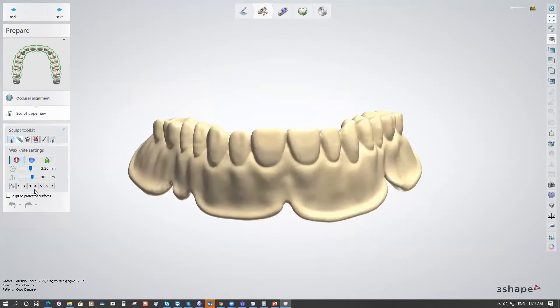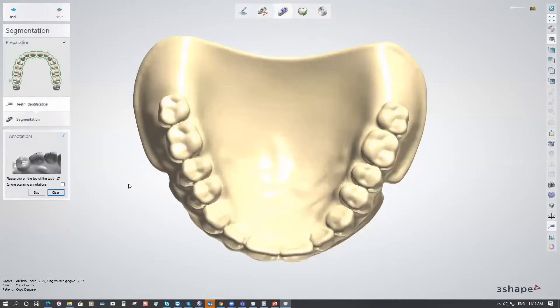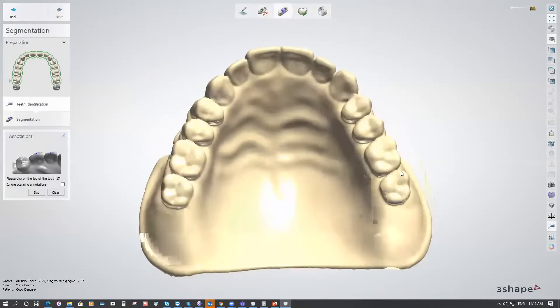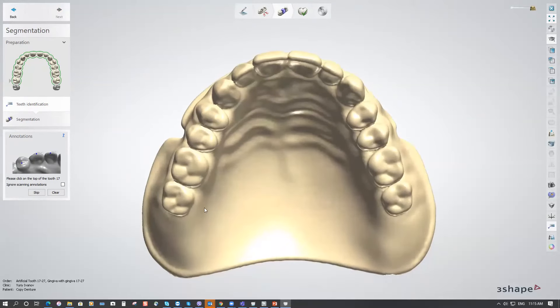Here you can use the Wax Knife on your scan. When ready, go to the next step. Clear everything and annotate the teeth to help the software identify each tooth and segment them from the rest of the scan and from the base. Click on the top of each tooth number — number two, like this — and continue for the rest of the arch.